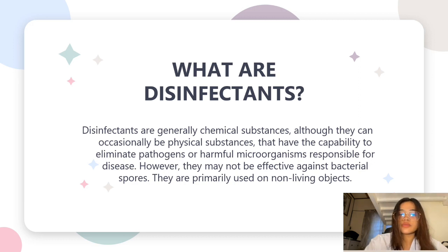Regular disinfection is crucial in healthcare, laboratories, households, and other settings to maintain a clean and safe environment. However, it's important to note that disinfectants are different from cleaners, which remove dirt and impurities but may not necessarily kill all microorganisms. So using disinfectants responsibly, understanding their limitations, and adhering to recommended guidelines contribute to effective infection control and public health measures.